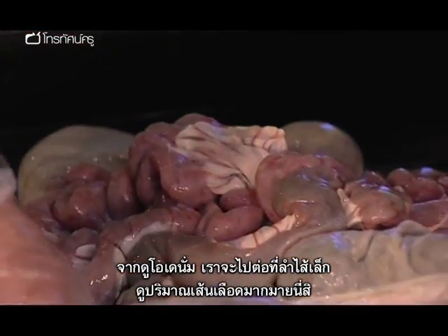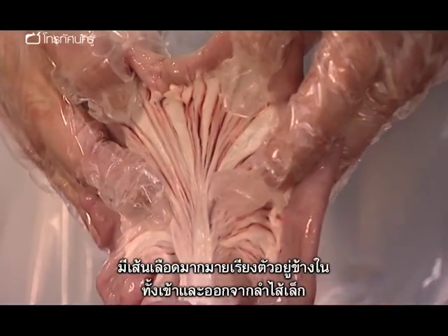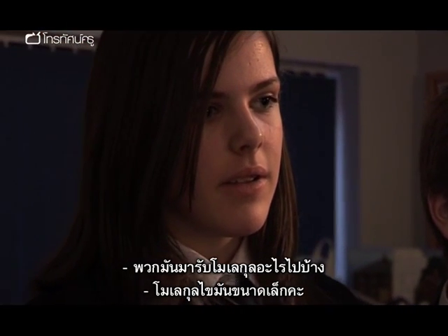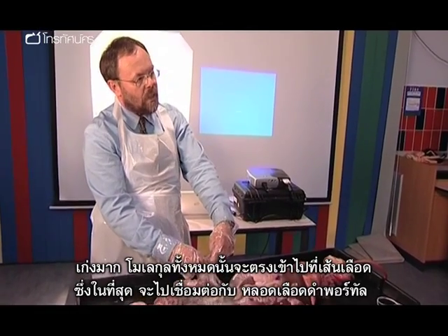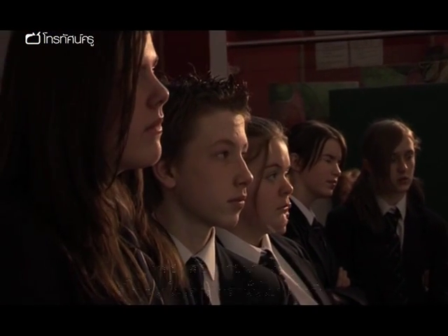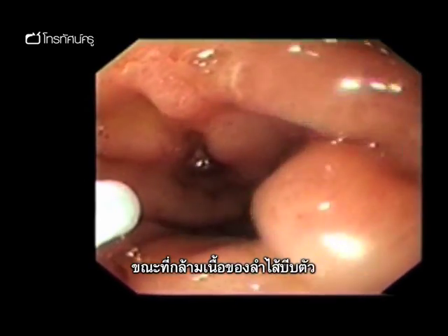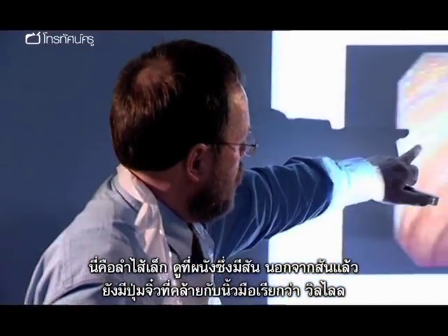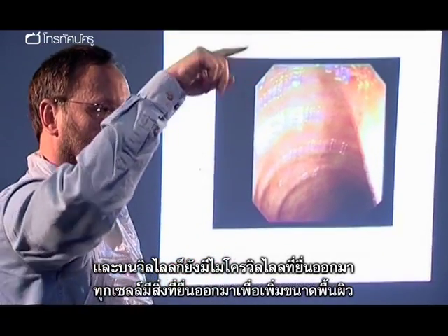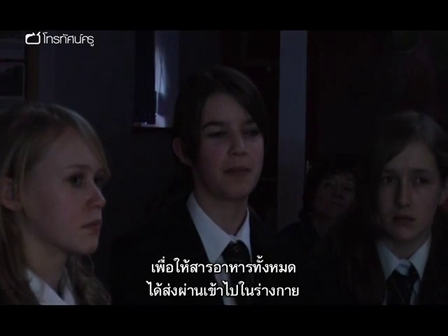"From the duodenum we head into the small intestine. Look at that extraordinary network of blood vessels — an amazing collection embedded in fat, going to and away from the small intestine. What are the molecules they're picking up? Small, soluble ones — brilliant. All of that heads into these blood vessels, eventually linking together in the hepatic portal vein, a big vein taking them up to the liver. Looking along the small intestine, you can see the wall with ridges, upon which are tiny finger-like projections called villi, and then micro-villi on those — every cell has these projections to increase surface area."